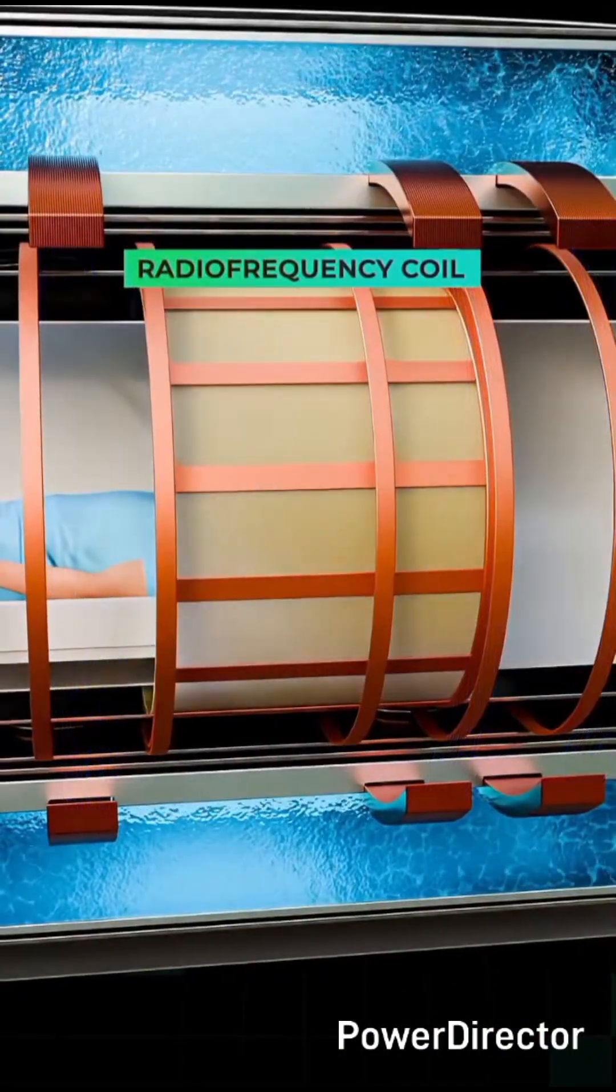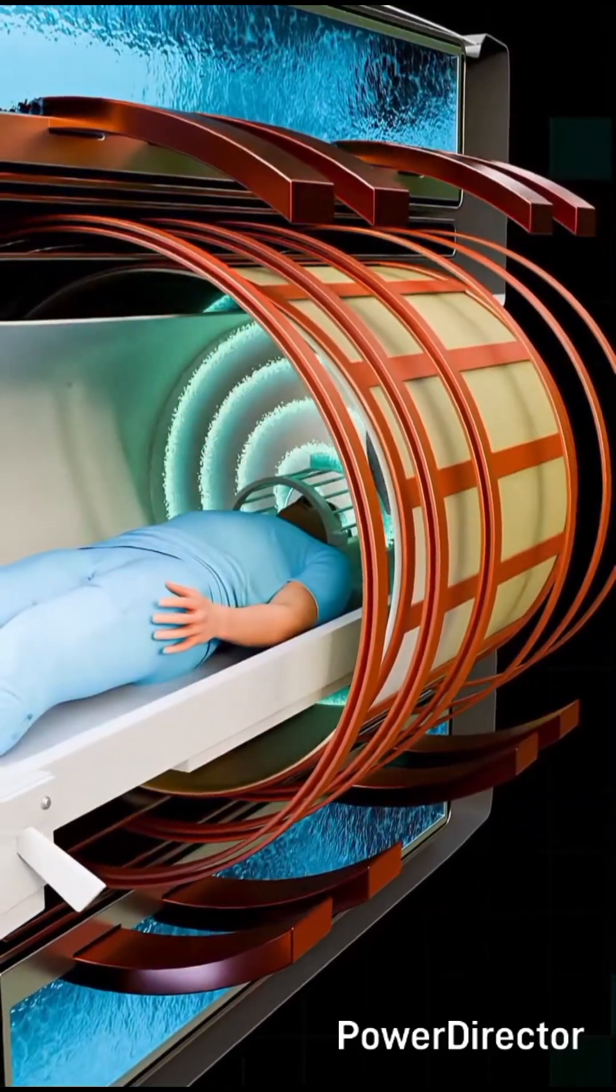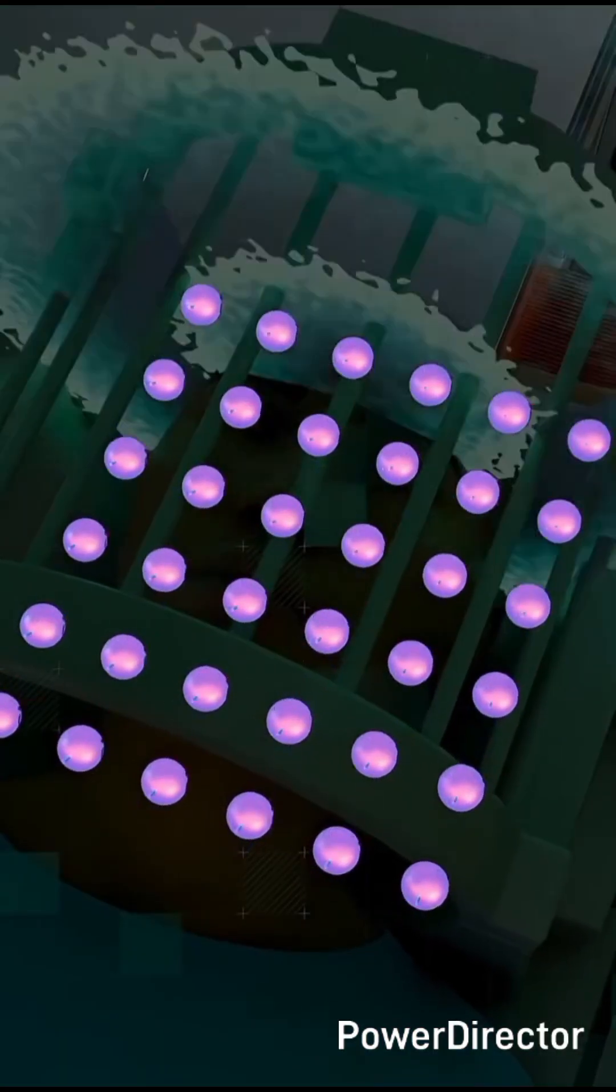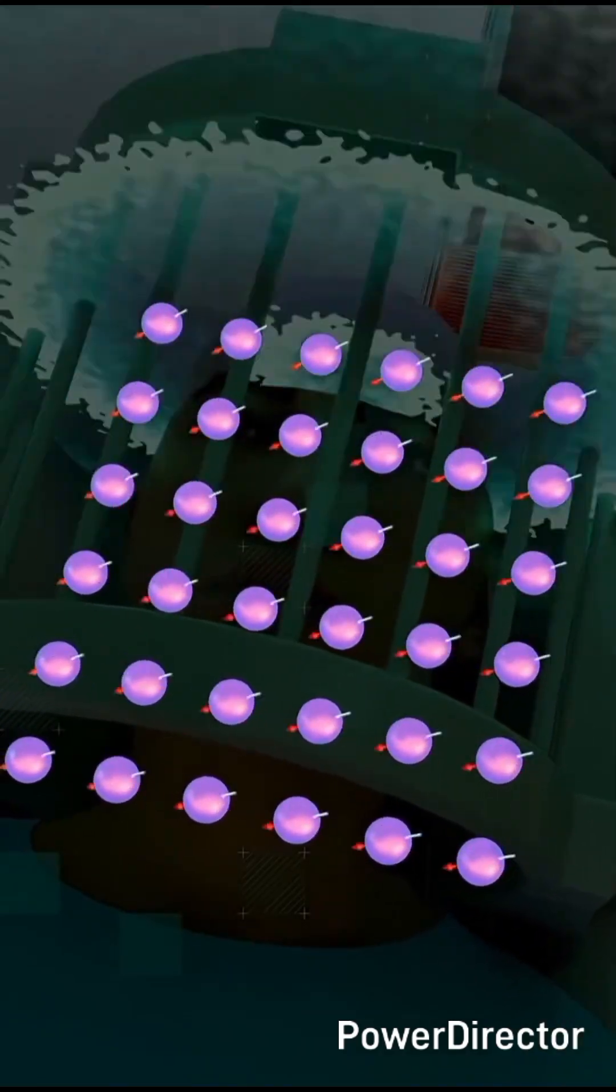Next, another set of coils, the RF coils, deliver a burst of radio waves. This energy knocks the tiny magnets sideways so that they begin wobbling together in sync along the transverse plane.